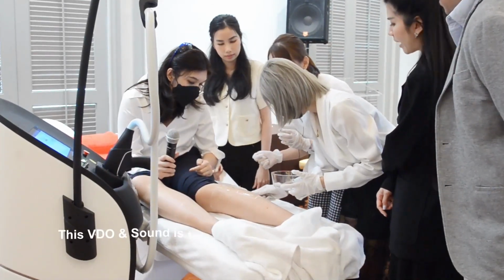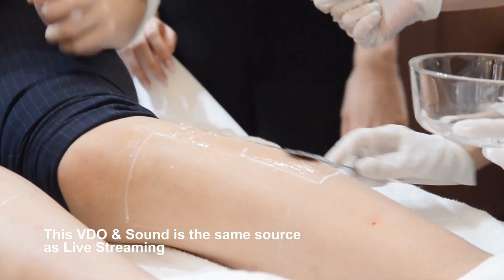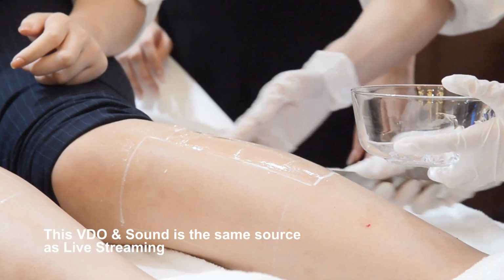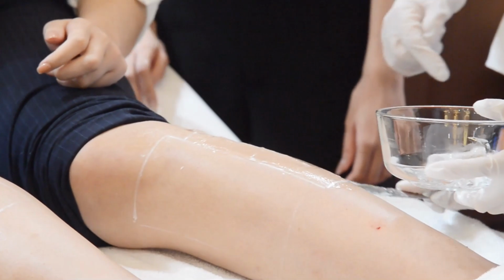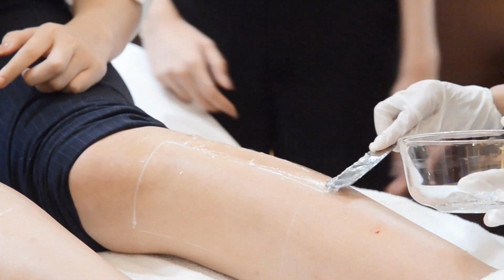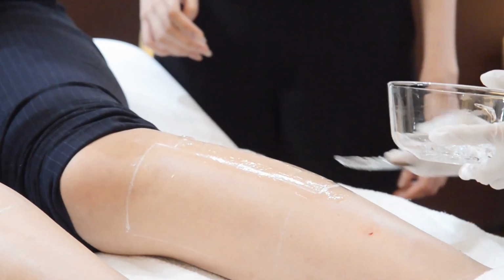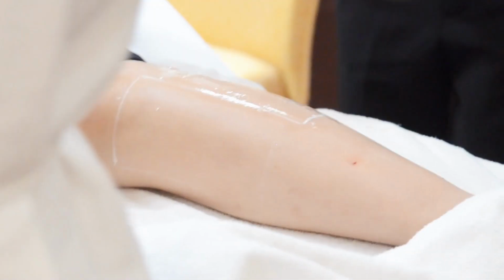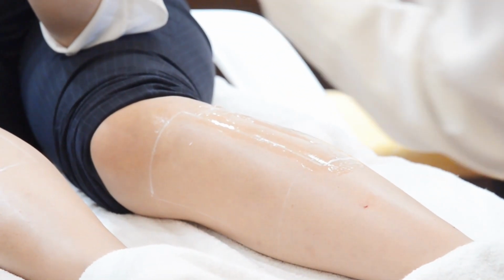Yeah, over here as well. Yeah, just cover the line. If it's good, overlap a bit. Yeah, it's good enough. You can glide. And then you can come here and press. I'm going to prefix everything.